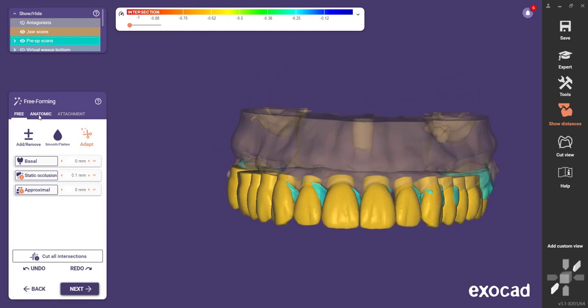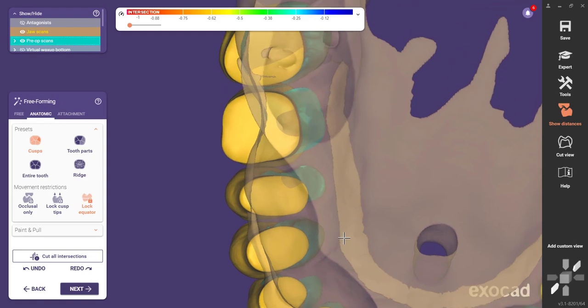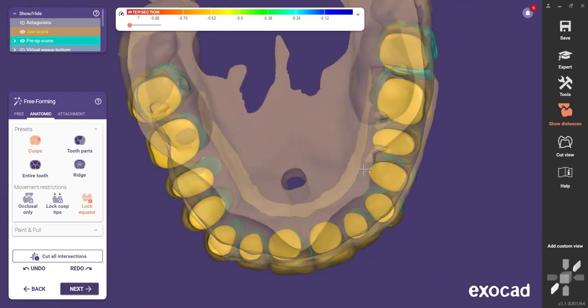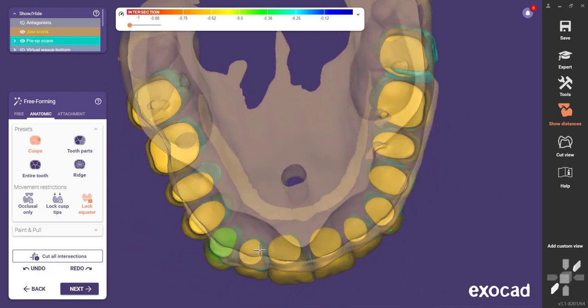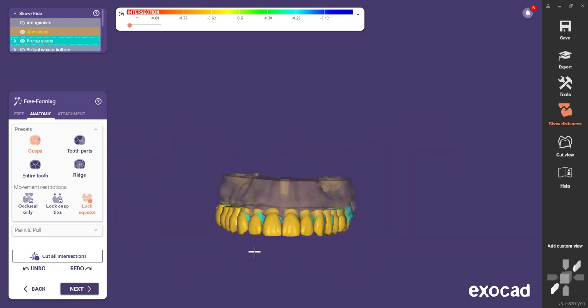It's reminded me I haven't adapted anything. I don't really care to adapt my contacts because this is all going to get fused together into one thing. However, one thing I probably should correct — let's go to Anatomic and say Lock the Equator. Some of these root prominences, I want to bring those on back. By locking the equator, that's going to kind of lock your anatomy in place but allow you to get the neck of the tooth so it's not sticking out so aggressively. Probably bring that canine back a little, and that one, and that one. Everything else I think we can work with.